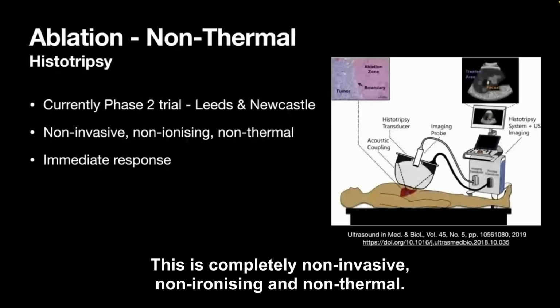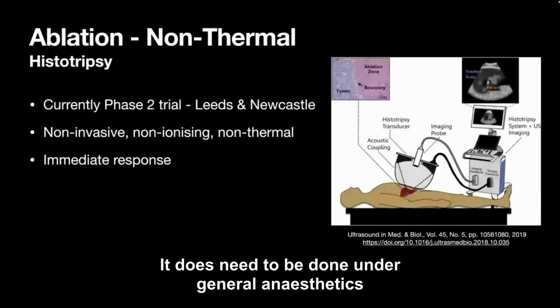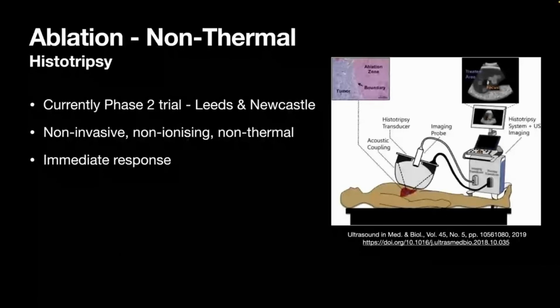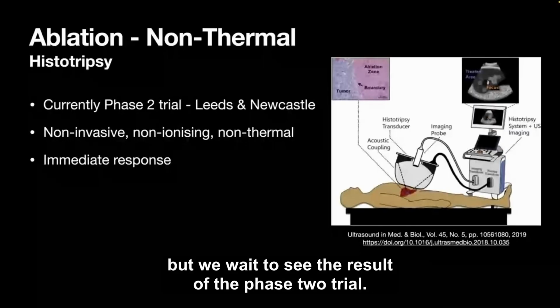This is completely non-invasive, non-ionizing, and non-thermal, and it does not involve putting even a needle into the patient. That does need to be done under general anesthetic because it could be painful, and there's a lot of setup in theatre to do. It does give an immediate response on the laboratory model, but we wait to see the result of the phase 2.